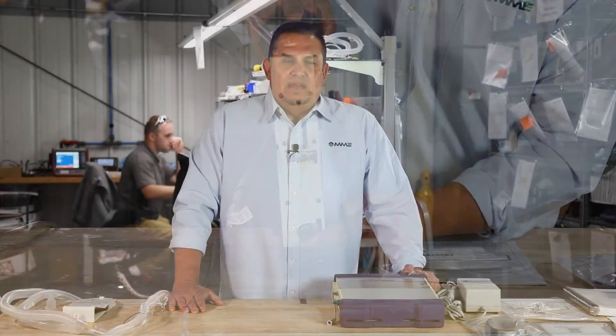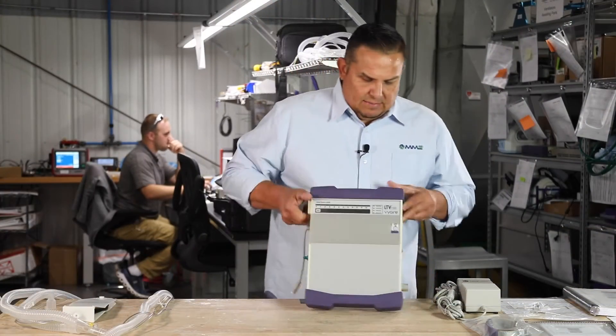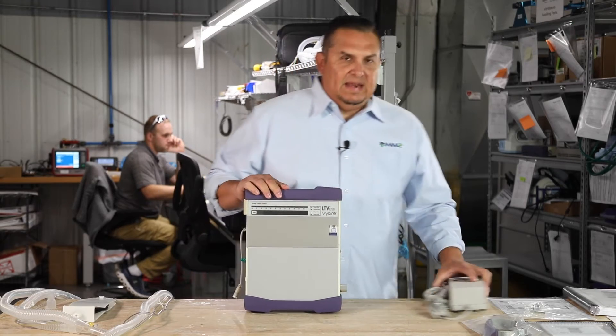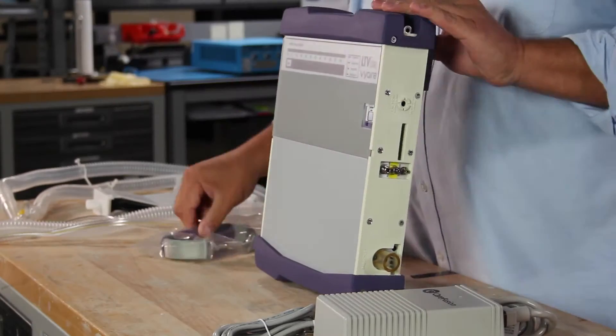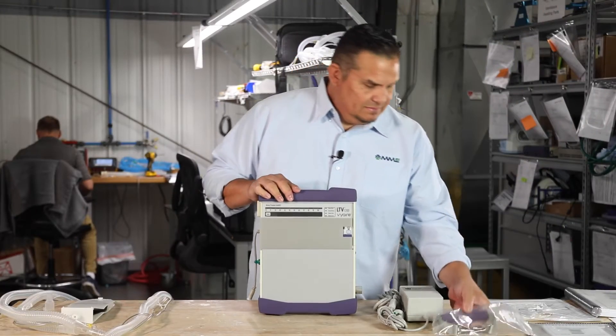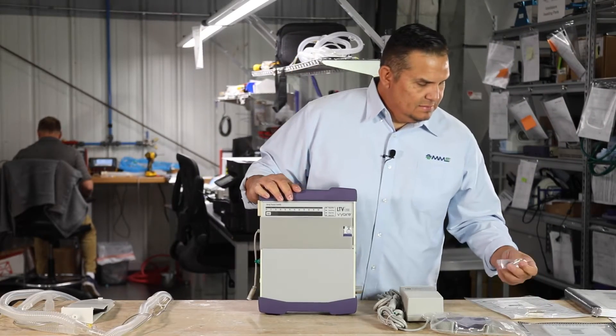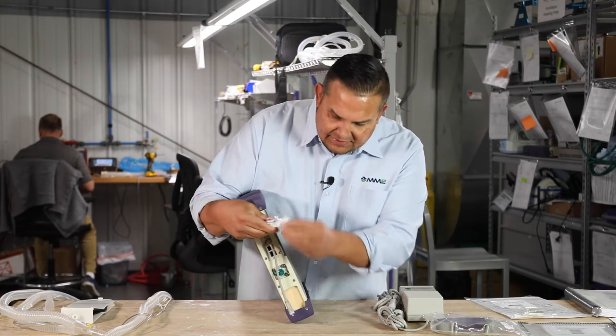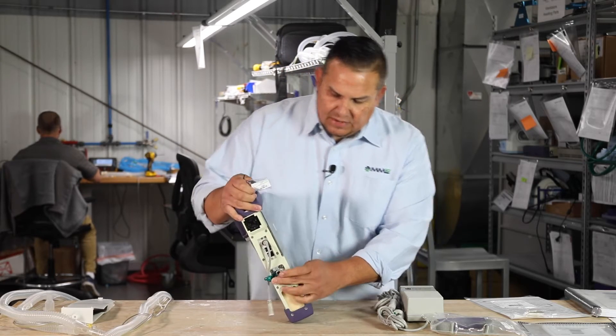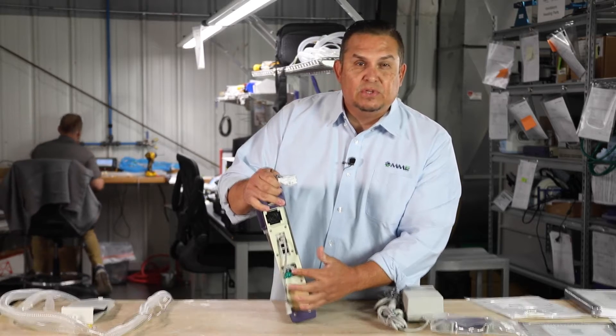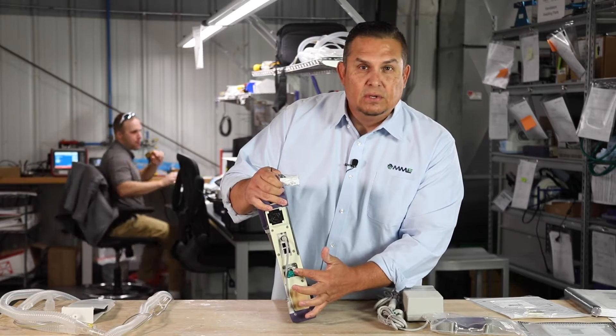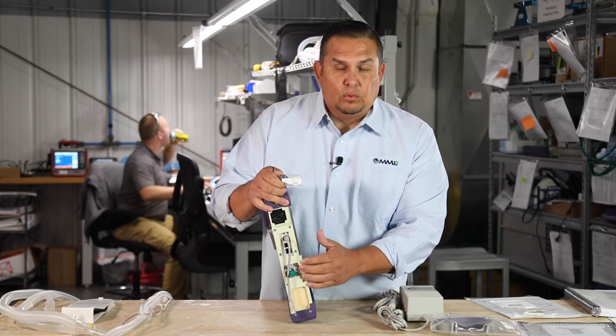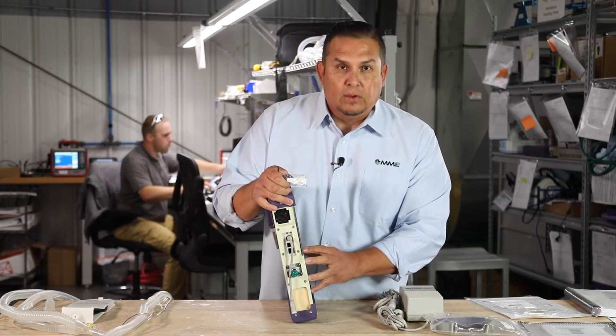Out of the box, the LTV 1200 comes with the ventilator itself, an AC adapter, a strap hand, and a Christmas tree that hooks up on the side which allows you to hook up to low flow oxygen. The LTV 1200 allows you to either run off high flow or low flow oxygen.